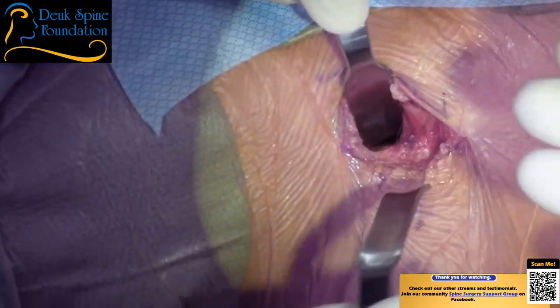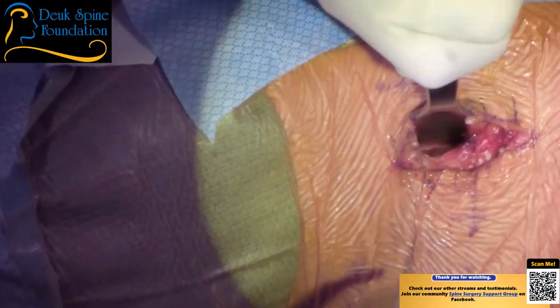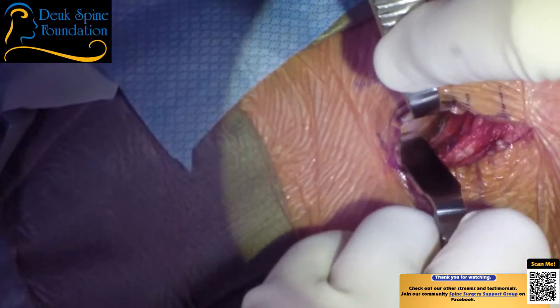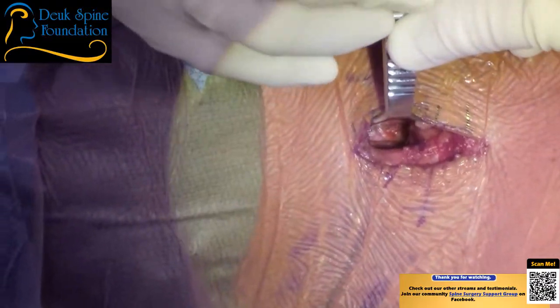Look, you need to be, see this shaft? It needs to be straight down. You're like this, which is relaxing your hand. It makes it easy for you, but it's not showing me what I need to see. You need to toe in. There's the carotid artery, and I can see the discs. You understand the difference? You're like this, easy, relaxed. You need to be like this, okay?